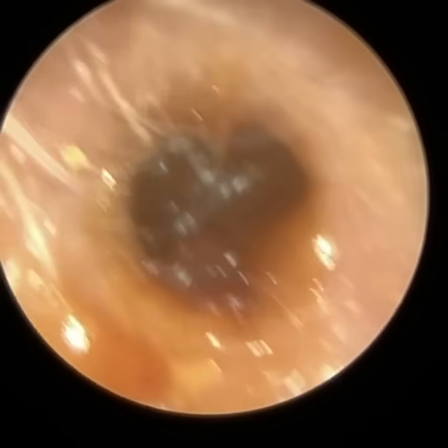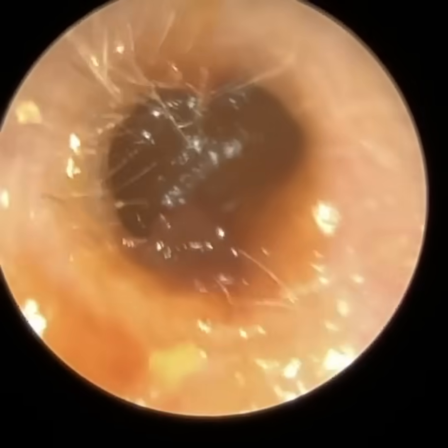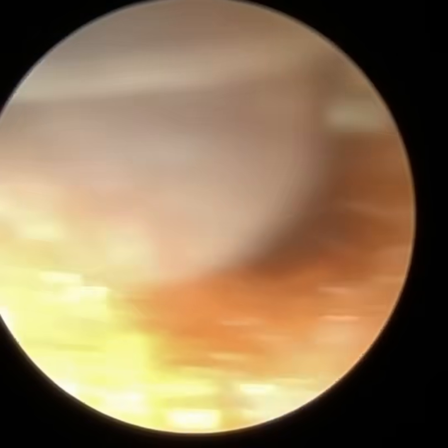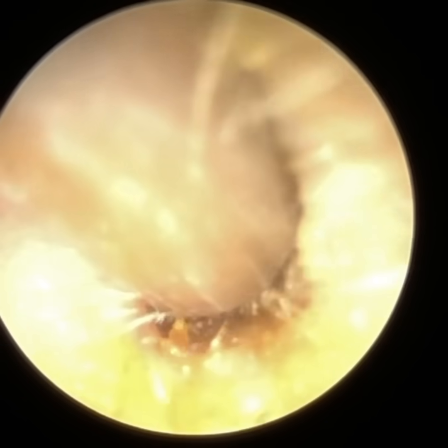Thank you for joining me in my latest video where I use both the iCLEARscope endoscope and also the WAXscope. And it's of a really technically challenging case of a patient in their mid-20s who has what we call a stenotic ear canal, so a narrow ear canal.